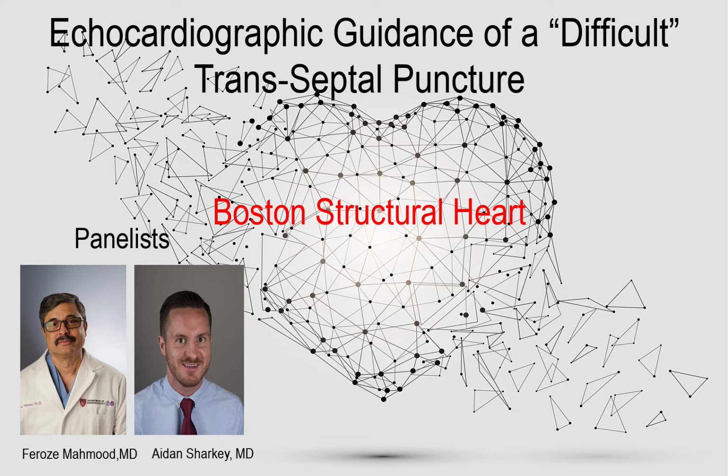I'm sure you've all been to those conferences and presentations where people present impeccable images that you are only once in a while lucky to acquire. This is a usual run-of-the-mill case with difficult transseptal imaging and difficult transseptal crossing. We've decided to present this case to address the problems that you face in daily life. As opposed to presentation quality images, these are usual images that you come across every day.